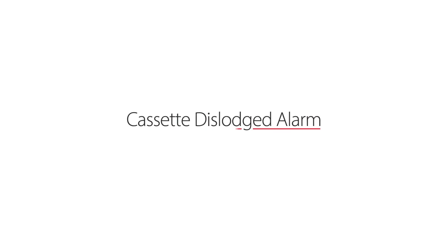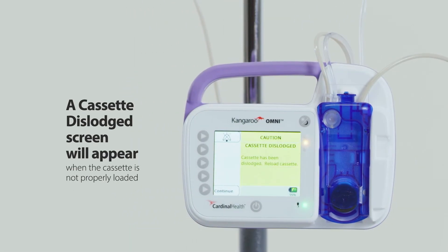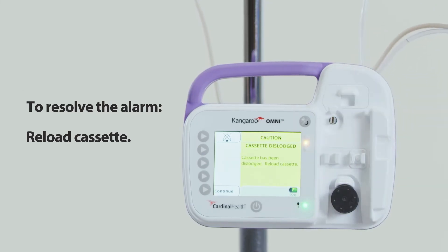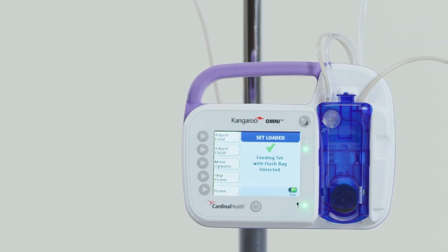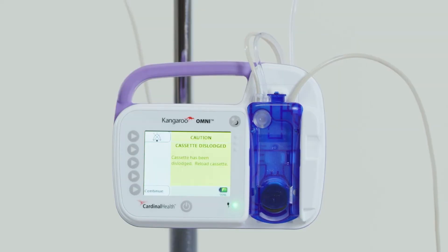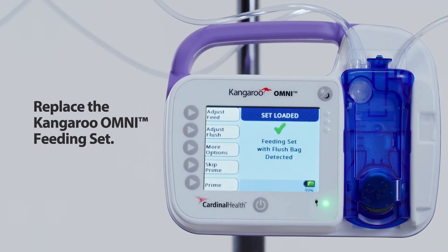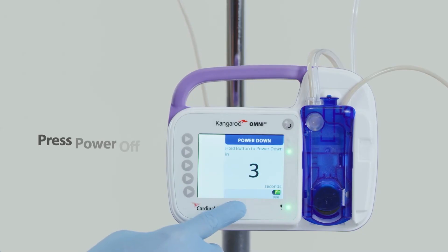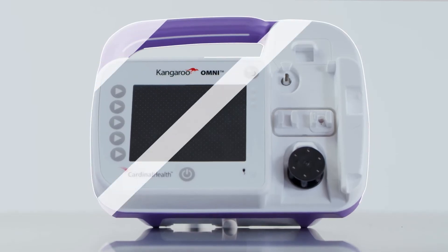Cassette dislodged alarm: a cassette dislodged screen will appear when the cassette is not properly loaded in the Kangaroo Omni enteral feeding pump. To resolve the alarm, reload the cassette. If the alarm continues, replace the feeding set. If the alarm continues after replacing the feeding set, press power off and use a different Kangaroo Omni enteral feeding pump.